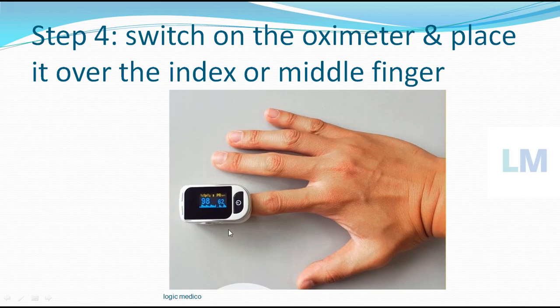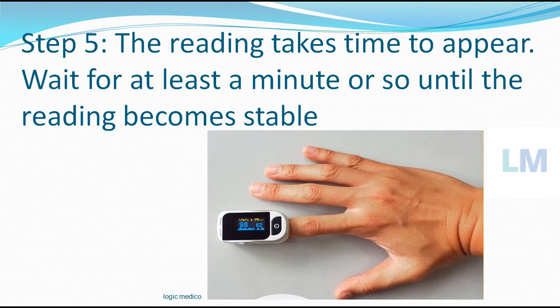Initially the reading won't display right away — it will take some time, so you have to have patience and wait. It will take time to record. The reading takes time to appear, so wait at least a minute or so until the reading becomes stable. Initially the reading may show 83, then 85, then 89 — it will be wavering around. You have to wait at least a minute, and 5 minutes is more appropriate, so that the reading becomes stabilized and does not change much.